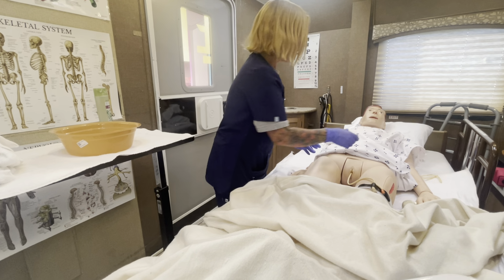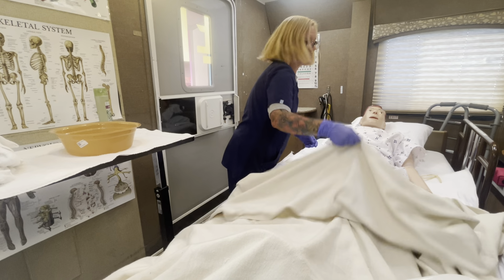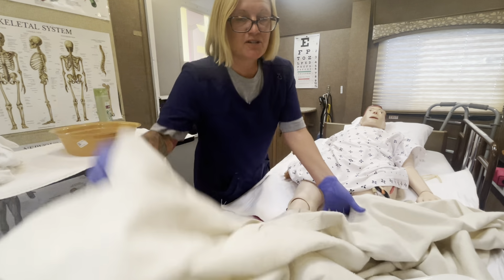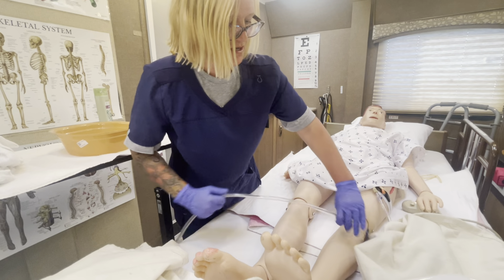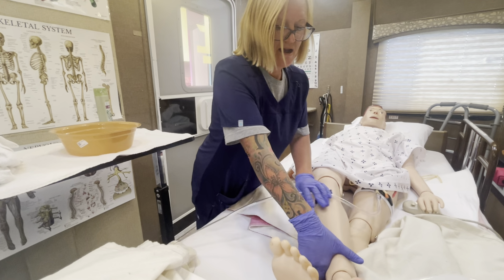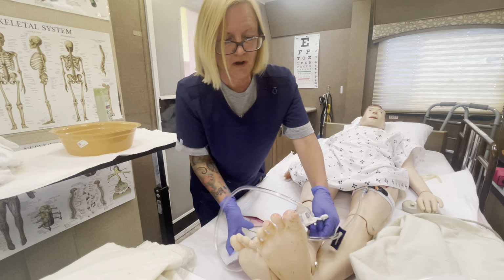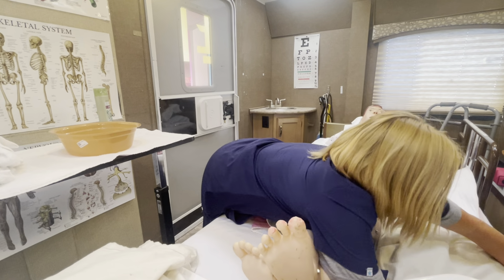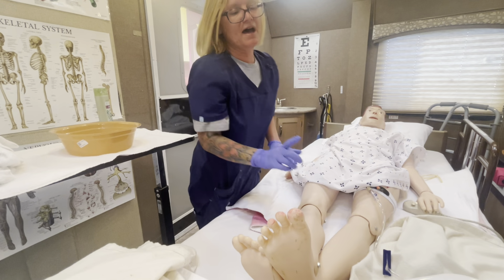All right, Miss Smith, I am all done. I am going to go ahead and roll you over and take the pad out. Again, I'm just going to show you. I would have the patient covered at this time, but I want you to be able to see. If I was going to change this bag, I could go over here and then place it on the frame of the bed. But you need to make sure that it's on the frame of the bed, okay?